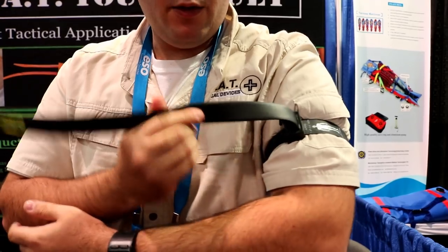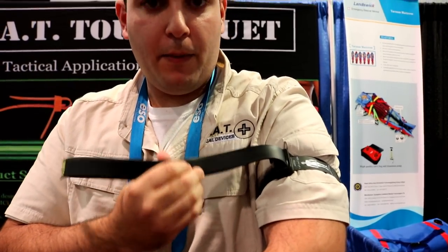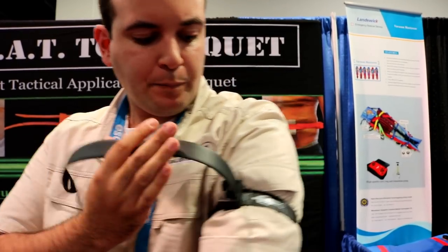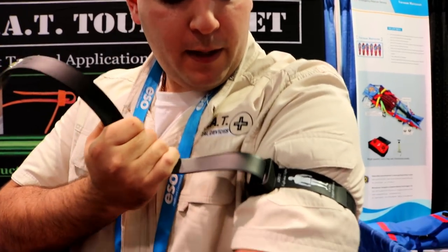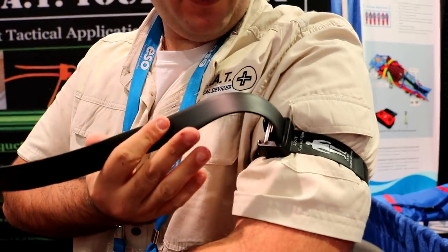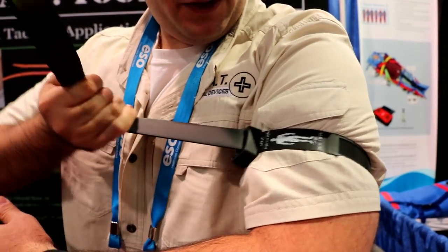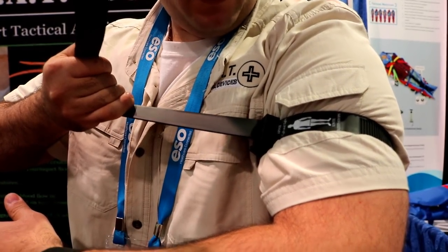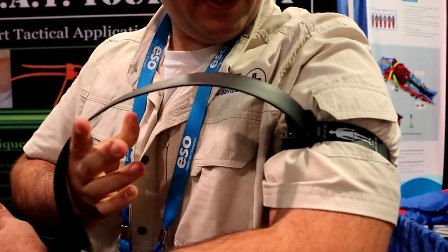The difference between this and your normal, ordinary zip-tie is that this is made out of a proprietary blend that actually stretches, causing more circumferential pressure. With a normal zip-tie, you would just stop — you wouldn't be able to occlude blood flow. But with our tourniquet, since it has stretch properties, you're able to stretch it, causing that circumferential pressure to occlude blood flow. So you don't have to worry about locking it — it locks itself.